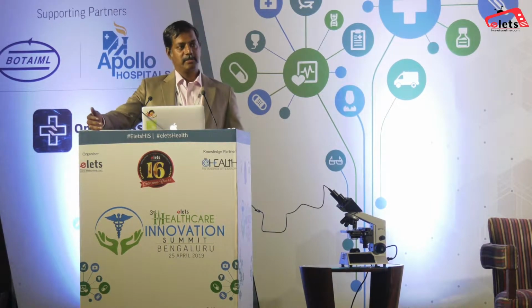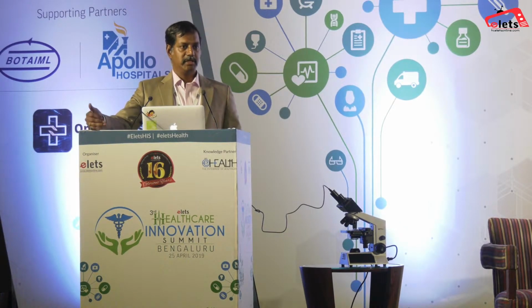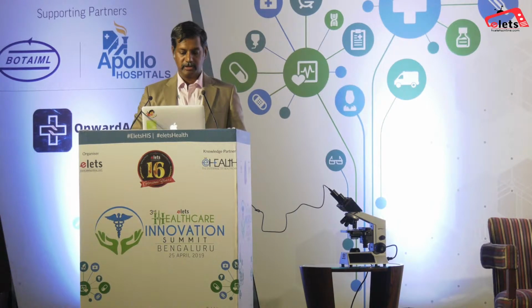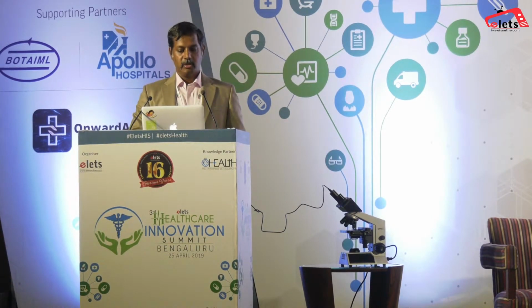The goal originally was you have these remote labs working in low resource settings. The amount of expertise available there may not be so high, but you do have a core expert, right? A larger team of pathologists sitting remotely. What if we could help the remote lab upload with very few clicks? So now that we've done that, I'll show what happens at the remote end.